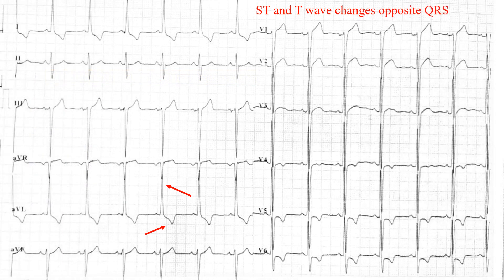For the ST and T wave changes parameter, the changes should be opposite in polarity to the QRS. We can see that the QRS is positive while the T waves are negative, and this pattern can be seen in many other leads as well. This confirms that opposite ST and T wave changes are present, so this criteria is fulfilled.